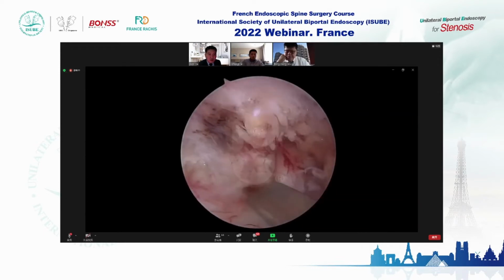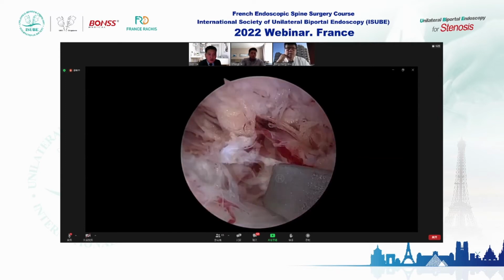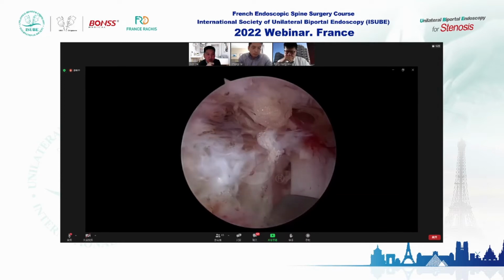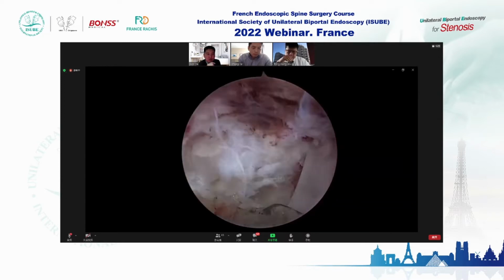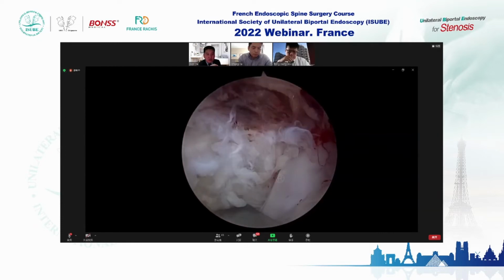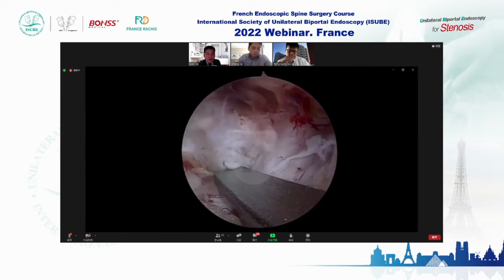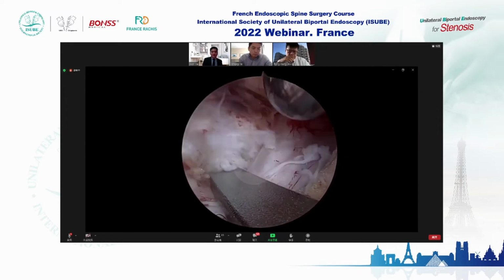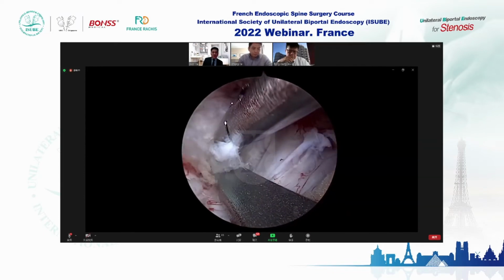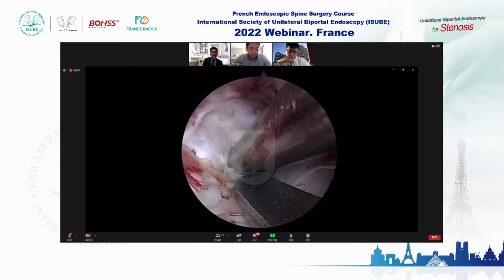So Dr. Zhang Wei said maybe the two approaches are the same to remove a sequestered fragment downward, but to do the foraminal disc fragment, Dr. Zhang Wei can see more in the foraminal area. Okay? Okay. Thank you. Learn a lot from you. Thank you very much, Dr. Zhang Wei. Thank you, Dr. Yu, for the introduction of the whole procedure.